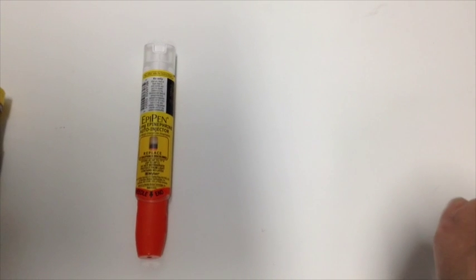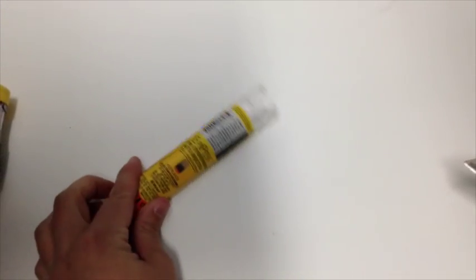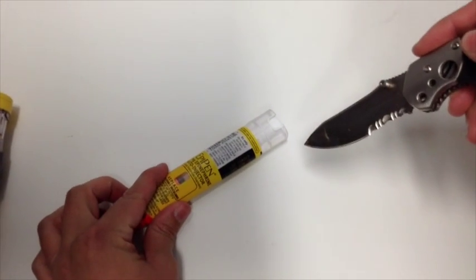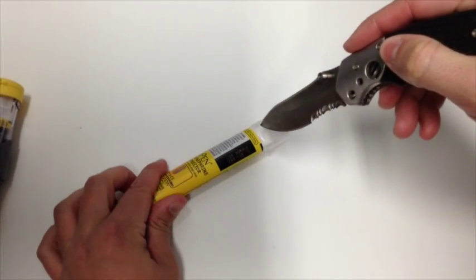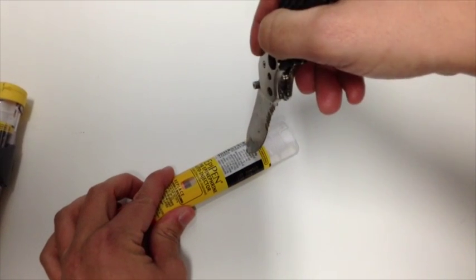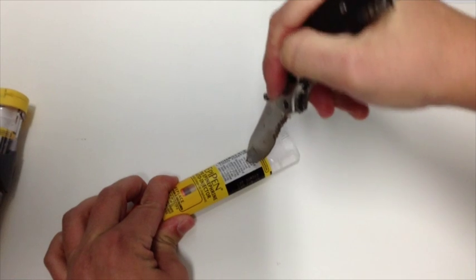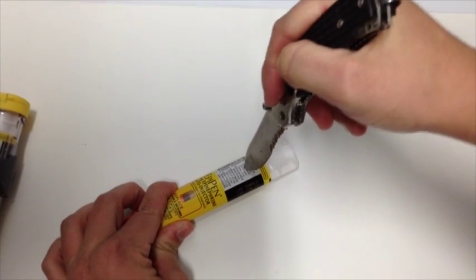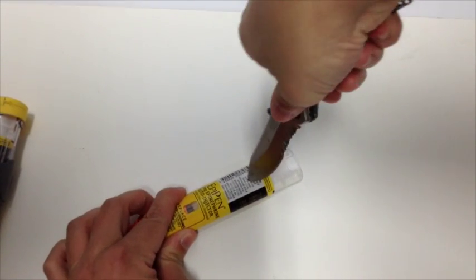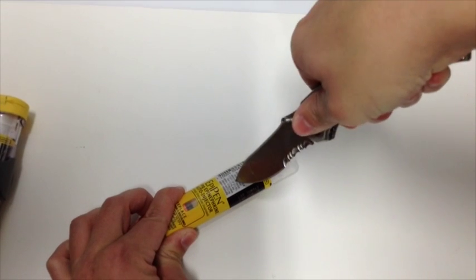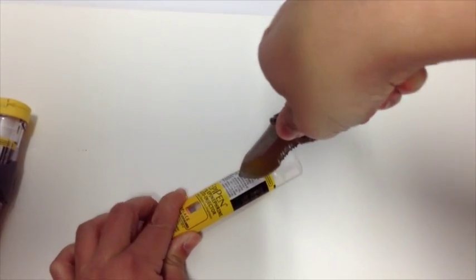So there is a spring inside here, so you have to be very careful once you puncture it and try to open it up because parts will kind of spring everywhere. So what we're doing here is just placing a small puncture towards the top of the EpiPen, just enough to get through the plastic and get to the point where we can cut it open further.